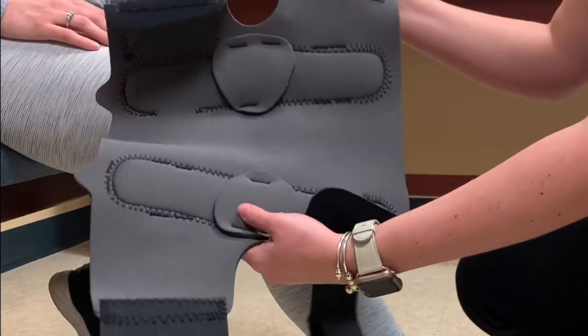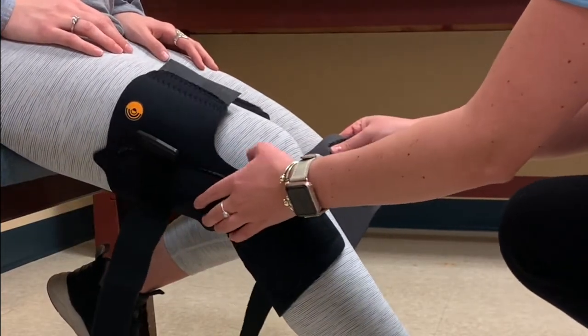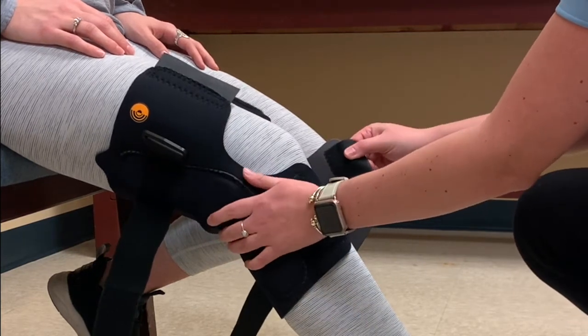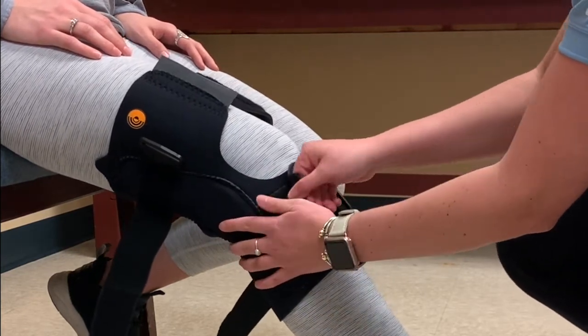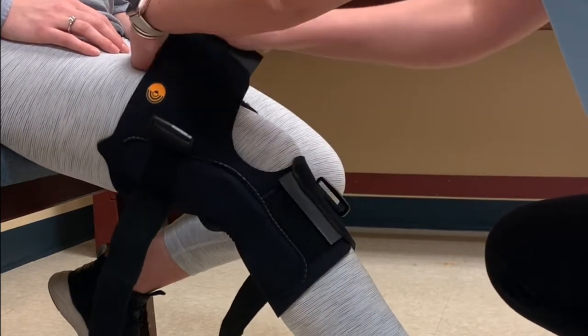With the patient seated, wrap the brace behind the leg, lining up the hinges on the sides of the knee. First start by closing the bottom closure first, nice and snug, then moving to the top closure above the knee.